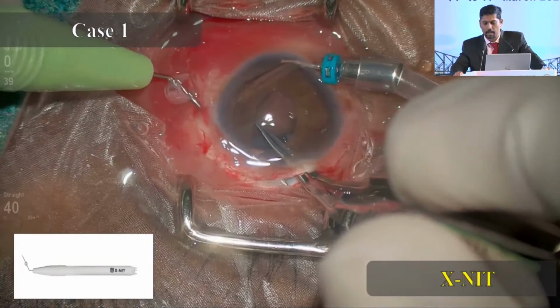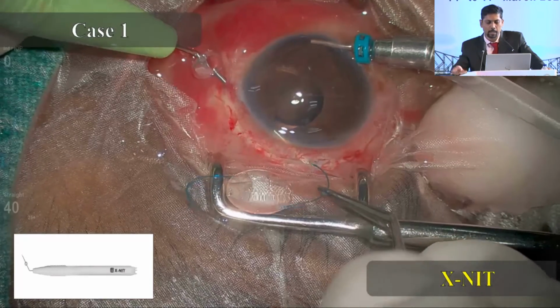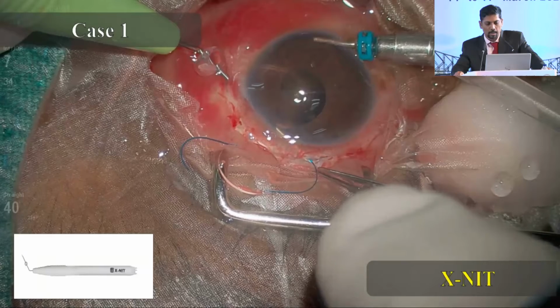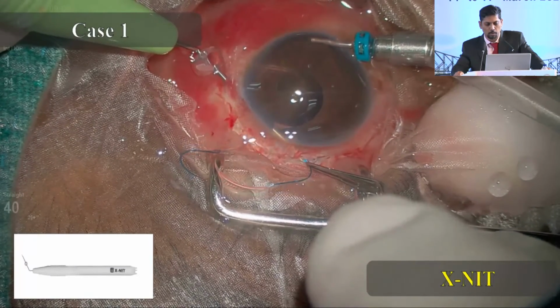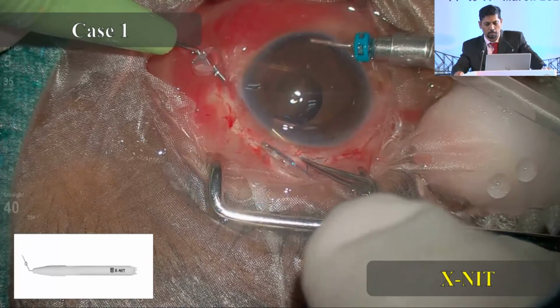Once you complete the arc, it's like an arc, the tip is outside. Remember, do not try to penetrate the tissue, penetrate and come out, and simply dock the haptic of a 3-piece IOL into the lumen of the 26 gauge needle. Around 2 to 3 mm of docking should be fine.